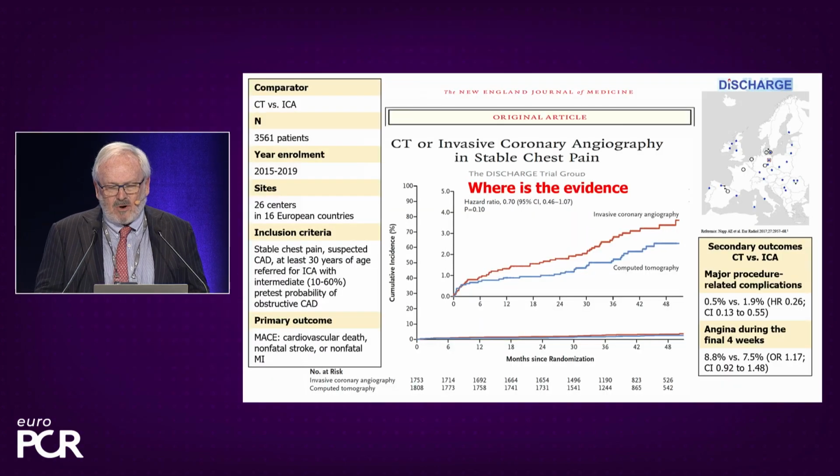That was excellent. I think it's time to show one slide. Somebody in the room asked, where is the evidence? So I'll show one slide about the evidence. That was the question. I don't have to repeat. You have seen all the potential. But the slide I want to show you, and that's the last one, is this one.